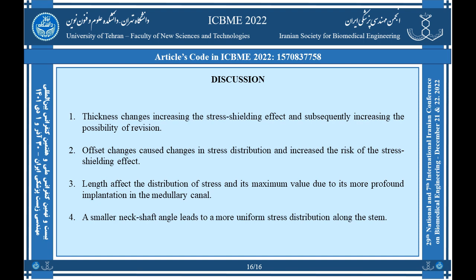Also, depending on the data obtained in this study, it was observed that offset changes caused changes in stress distribution and increased the risk of the stress shielding effect. It was also observed that a greater length could positively affect the distribution of stress and its maximum value due to its deeper implantation in the medullary canal.